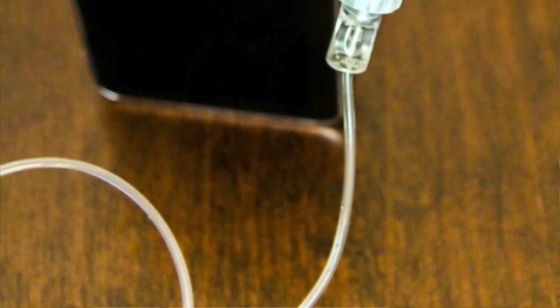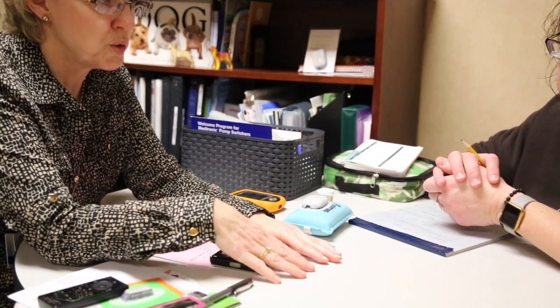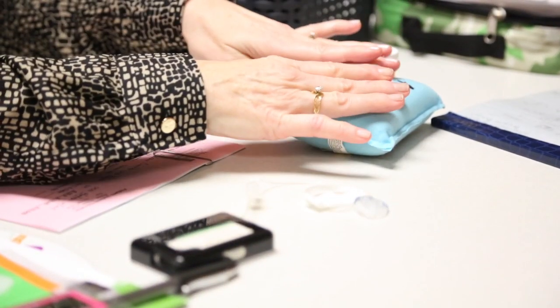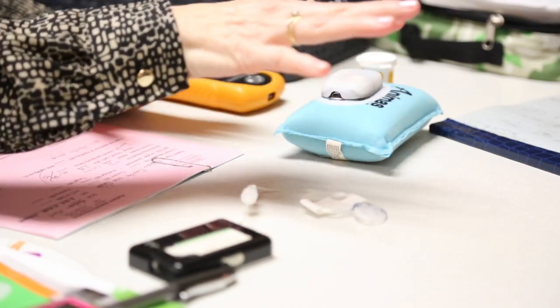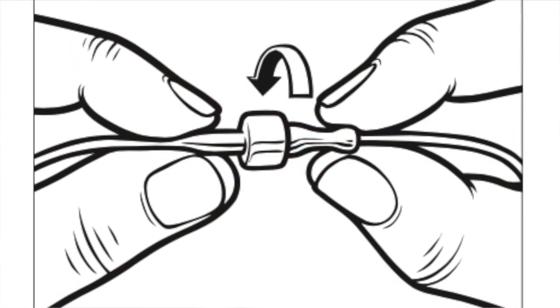Making sure that the tubing is connected, making sure that the tubing is full of insulin, making sure that it stays on your body can lead to some failures in this system. There's more user error. Whereas this goes on automatically, you just push buttons, it goes in at an established angle, and we don't have a connection, we don't have the tubing. We don't have the disconnect.